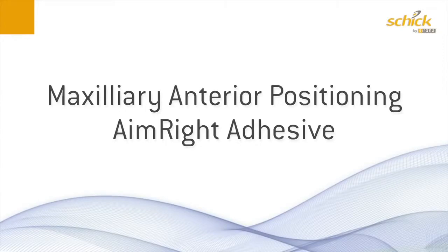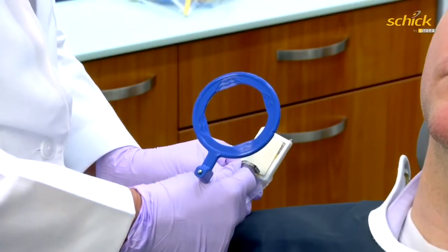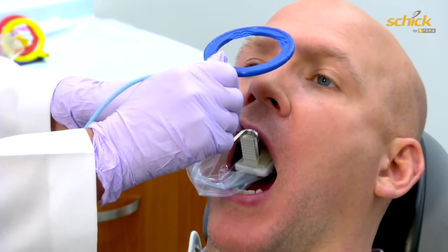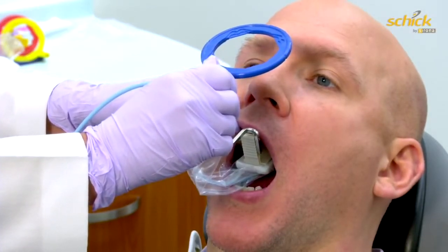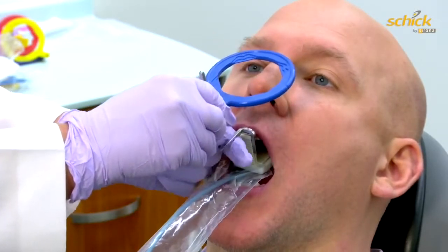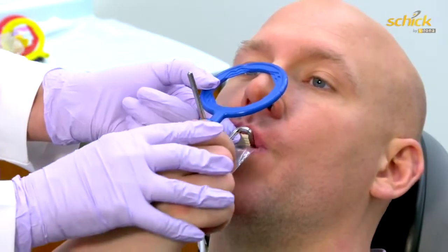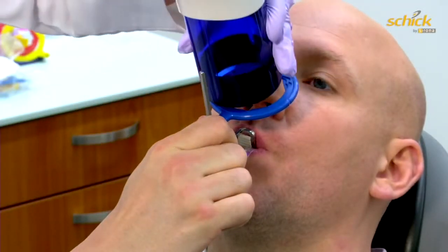For this shot, the tab is placed directly in the center of the sensor. Scoop the sensor into the patient's mouth, bringing the bite tab up to teeth 8 and 9, resting them 3/4 of the way out on the edge of the tab. Bring the ring to the patient's nose, have the patient close gently, and if necessary, have the patient support the bar. Bringing the cone in full circumference with the ring.